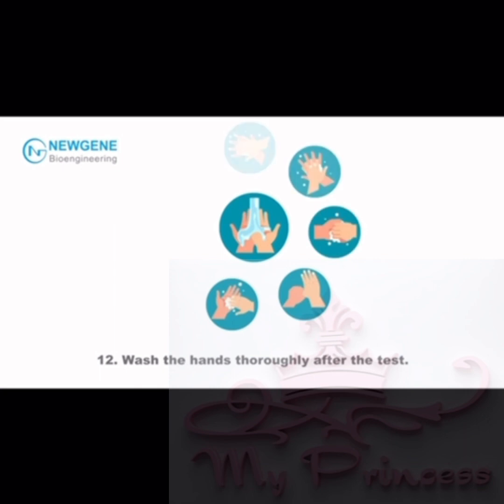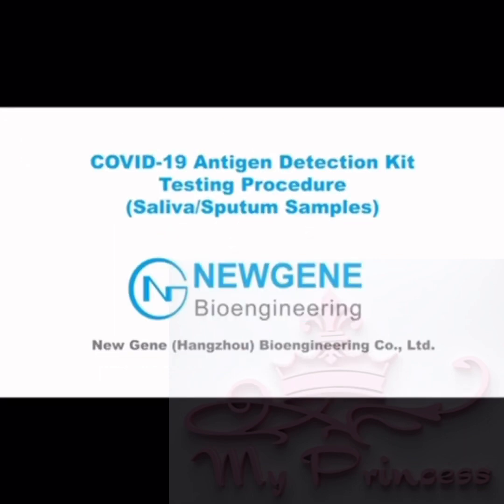Step 12: Wash your hands thoroughly after the test. COVID-19 antigen detection kit testing procedure.